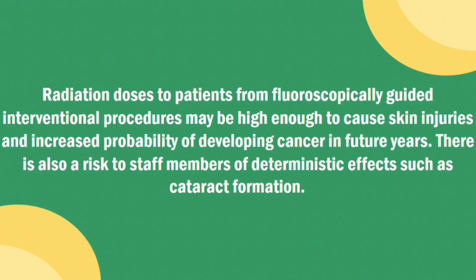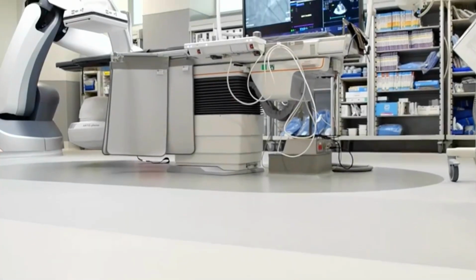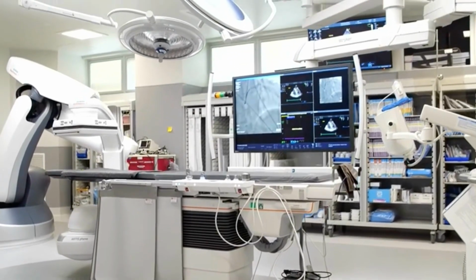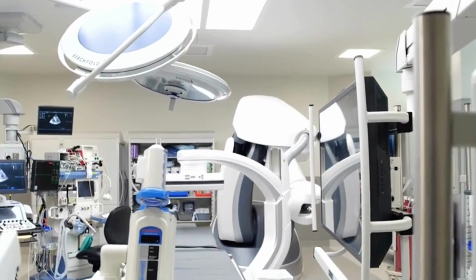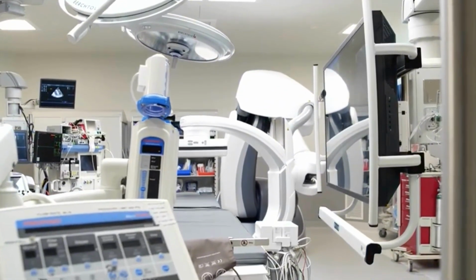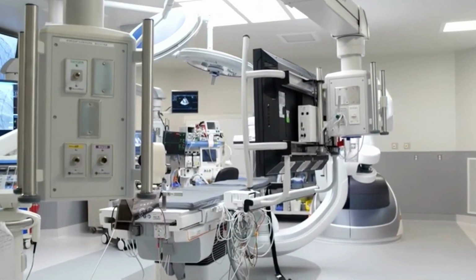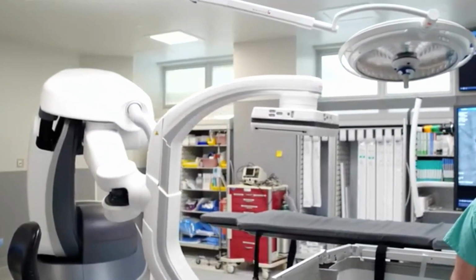There is also a risk to staff members of deterministic effects such as cataract formation. Although many fluoroscopically guided interventional procedures are conducted in radiology departments, they are increasingly performed by non-radiologists in other areas of the hospital, such as the hybrid operating rooms. It is important to ensure that adequate radiation protection training and support services are provided to staff members involved in fluoroscopically guided interventional procedures in all areas of the hospital.